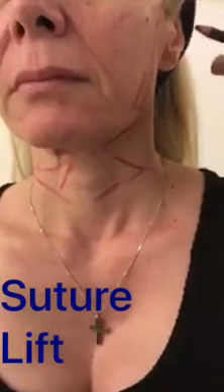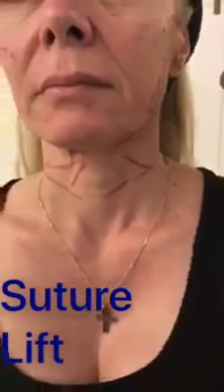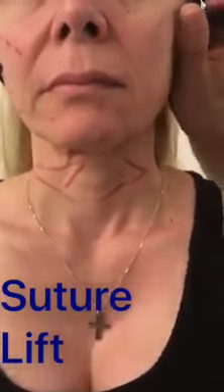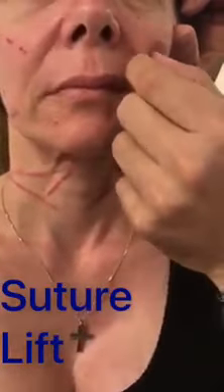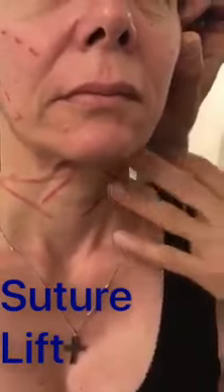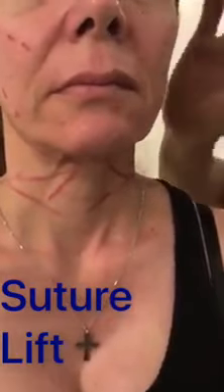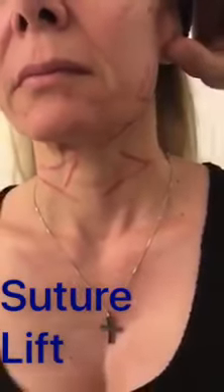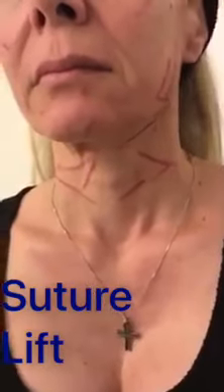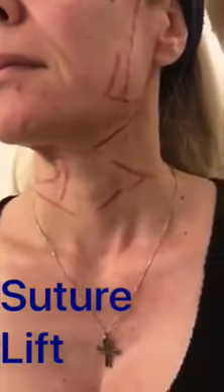What we will do today is apply four Happy Lifts lifting threads in order to elevate the face and correct the ptosis of the jowling, of the labiomental fold, and of course of the neck. The threads will be placed in the area of the face, on the cheek and zygoma and on the neck, in a position that has been drawn on this patient's face in order to provide an aesthetic outcome.